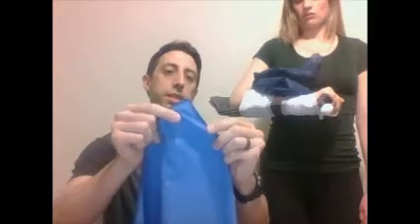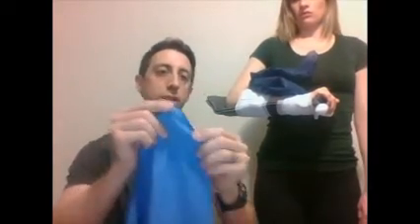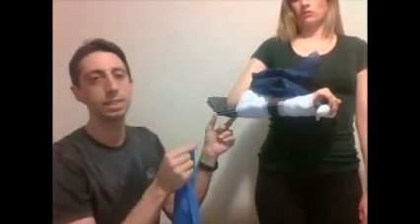And when we set up this sling, we want to make sure that this point goes to the joint, in this case, the elbow. So I'm going to get my patient just to move their arm away from their body so we can slip the triangle bandage in between the arm and their body. Okay, point is to the joint. That's the 90-degree point of the triangle bandage to the elbow. And now the rest of this just comes up and around the back of the neck.